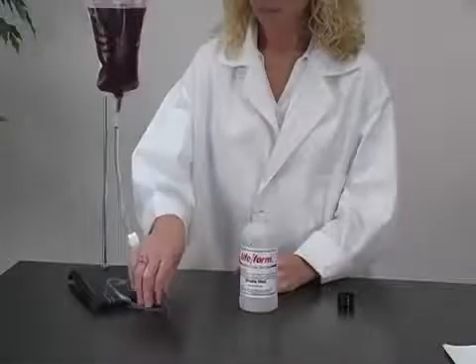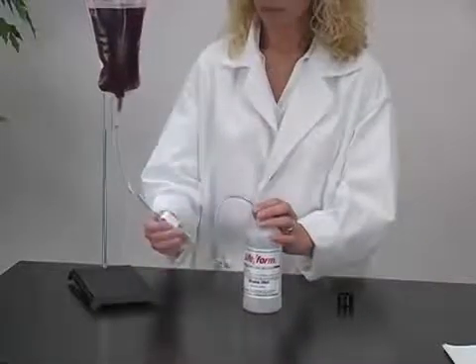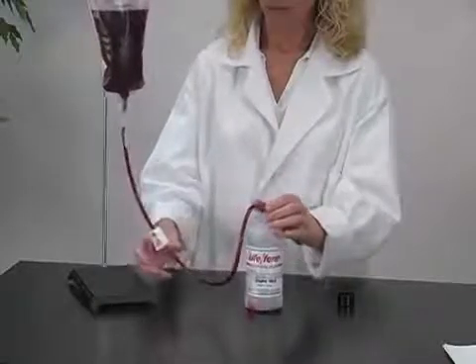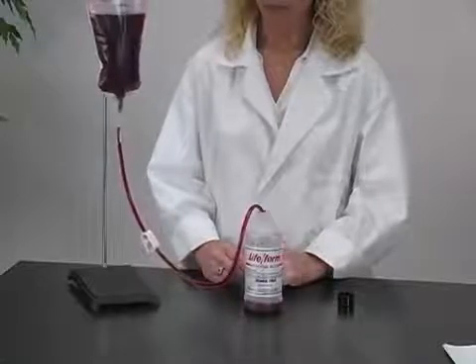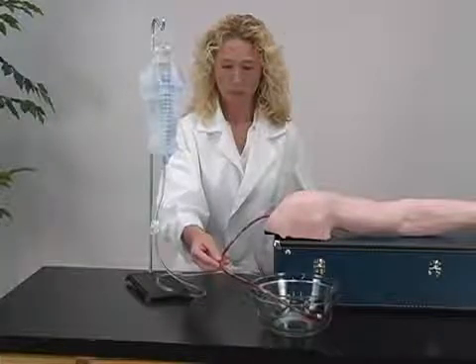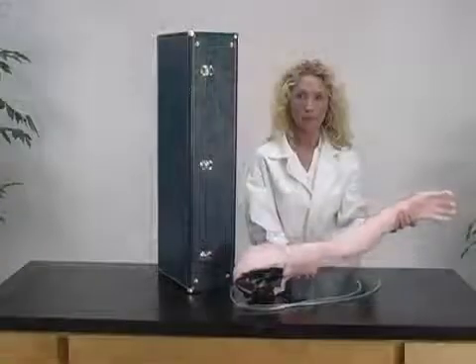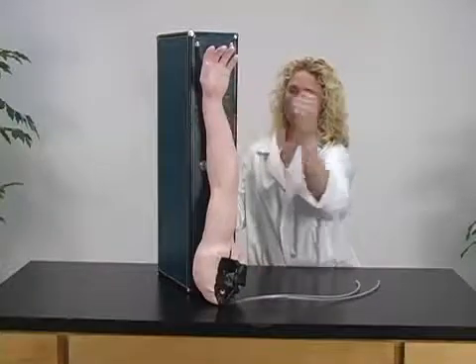After each class use, disconnect the venous blood and flush the venous system. You may reuse the synthetic blood by emptying it from the IV bag into a plastic bottle. To flush the arm, rinse it thoroughly with normal water, then tilt the arm upside down and allow time until properly dried.